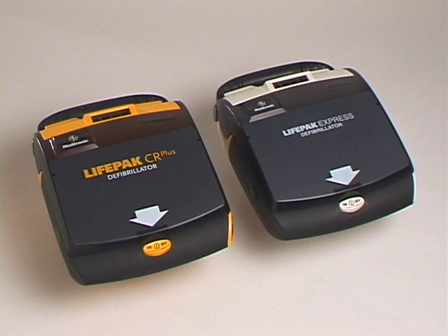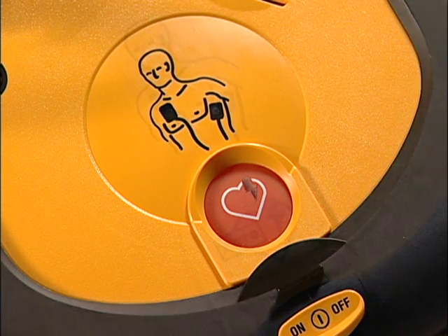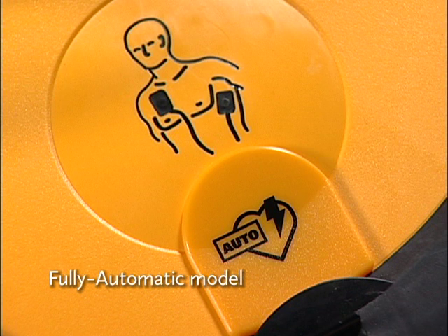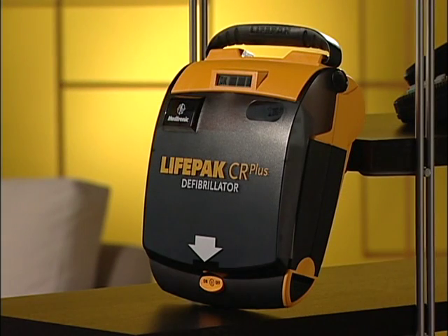This video covers the operation of two LifePAK AEDs, the LifePAK CRPlus and LifePAK Express defibrillators. The semi-automatic model has a shock button that you press when instructed by the AED. The fully automatic model does not have a shock button and delivers the shock automatically. Because the operation of these AEDs is so similar, we'll use only the LifePAK CRPlus AED in this video.